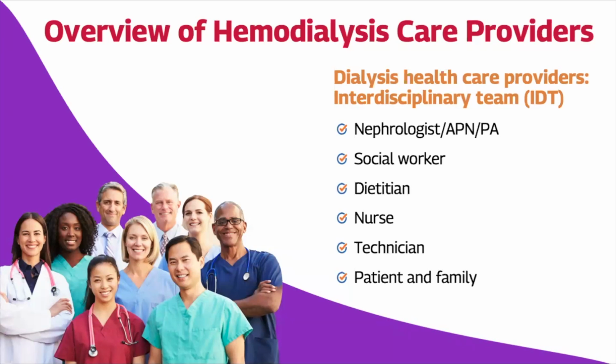The nurse is involved with volume status of the patient, vital signs, cardiovascular and respiratory status, treatment tolerance, and patient safety. The RN is the communicator in the team. We all work together to take care of the patient. Nurses also delegate patient care to the dialysis technicians in our centers. They prepare equipment, evaluate vital signs, initiate treatment, and monitor the patient. They're a very valuable part of our team. And last but not least, we partner with the patient and the family because it is essential to ensure quality of care.